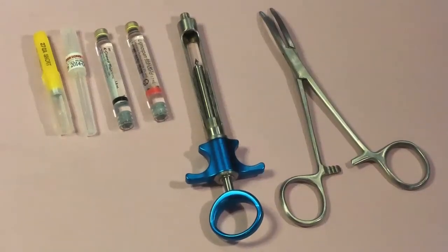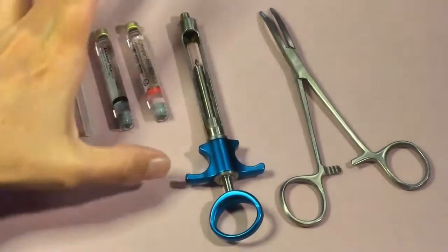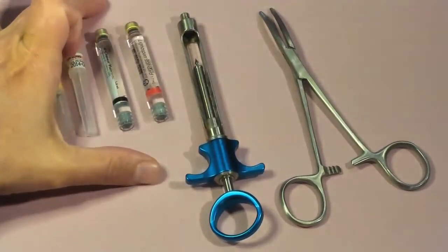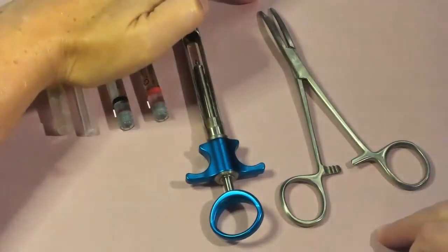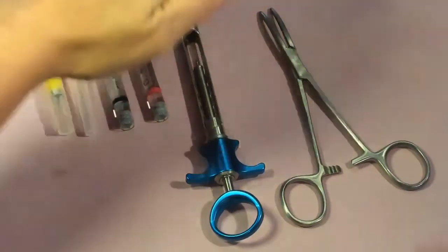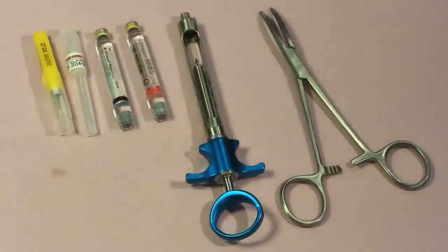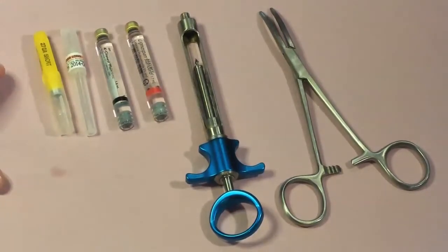In today's video we're going to be talking about armamentarium for dental anesthesia. Some of the basic armamentarium includes needles, anesthetic cartridges, a syringe, and a locking hemostat. We're going to look at each of these different items and talk about the different components for each.